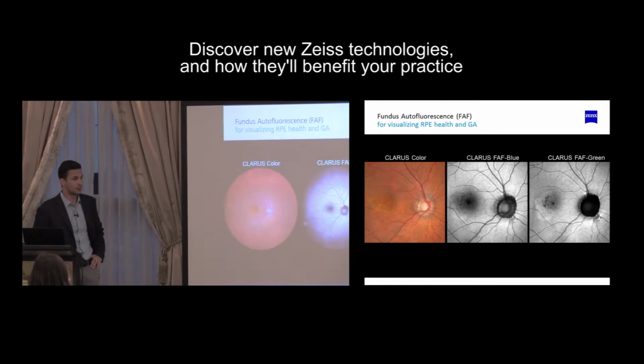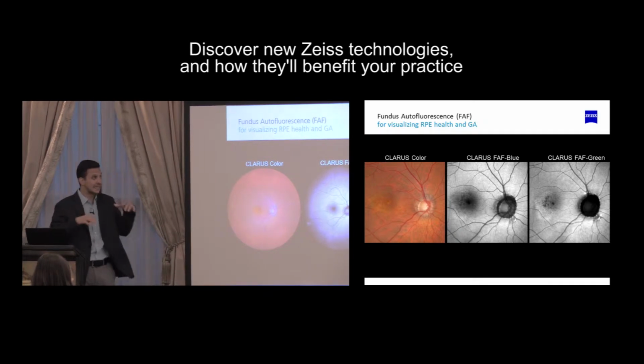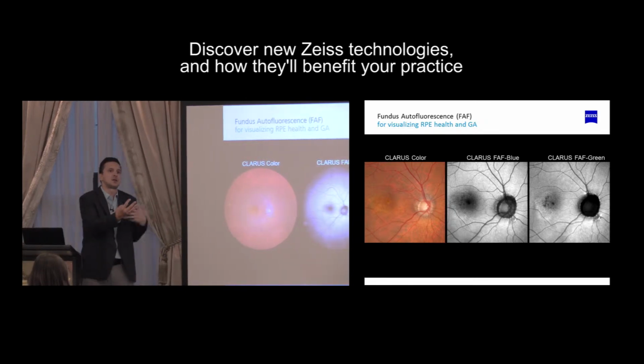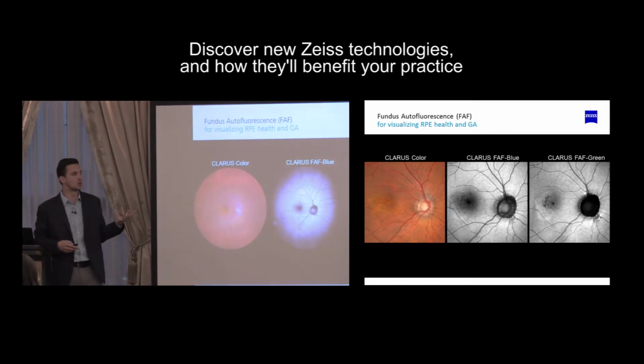Here we are on fundus autofluorescence. Now, the difference in our FAF green and our FAF blue is getting us out to the edge of geographic atrophy. So that's the other corollary or the draw-in. If we're thinking about how this relates to OCT, FAF green can be really useful for that. FAF blue just is absorbed in the pigments.